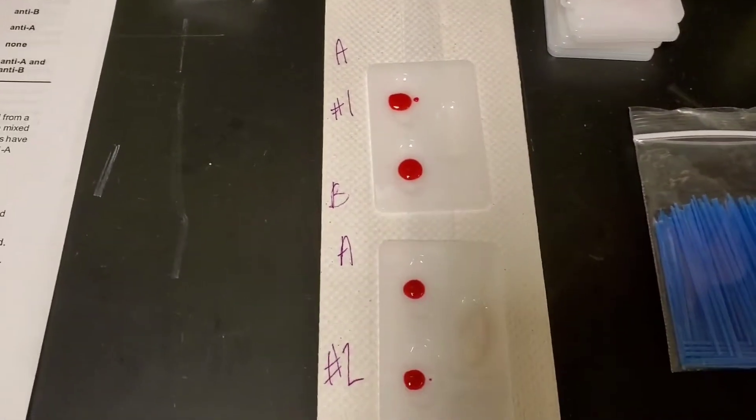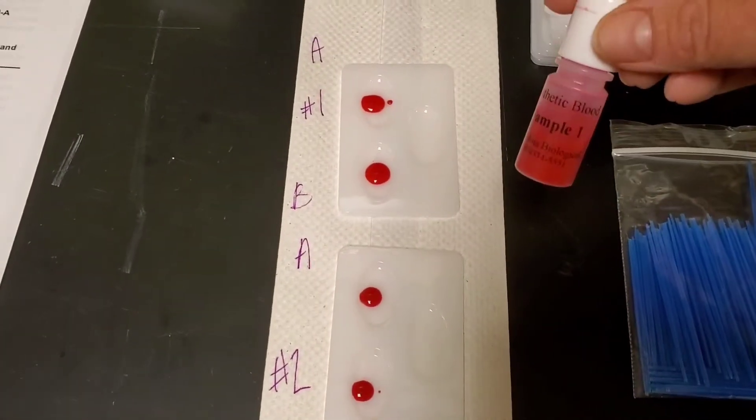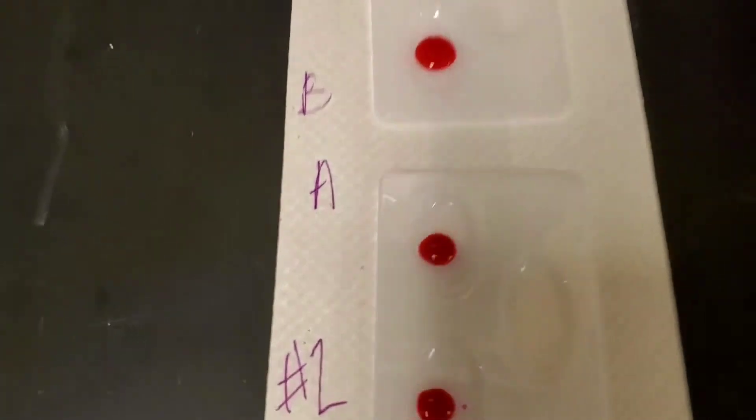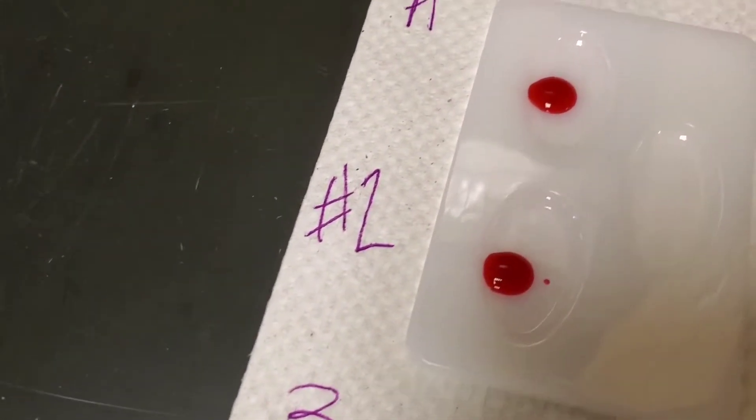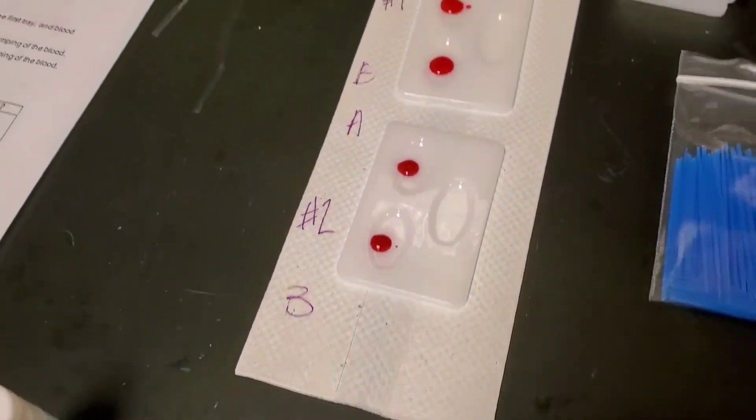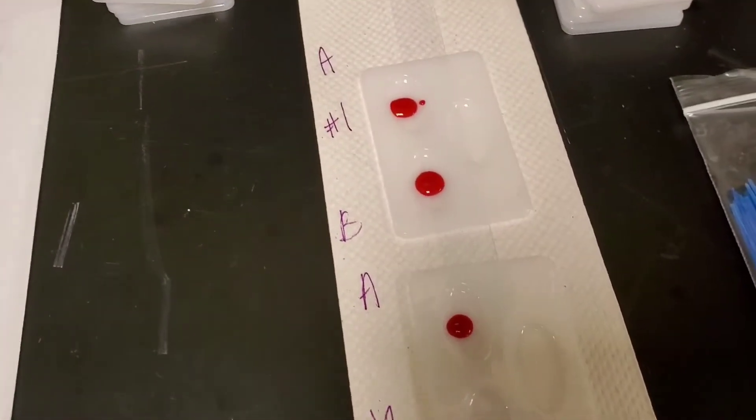Now I've taken the sample of blood and dropped it in there, so you can see it's shiny. There's no clumping going on, it's a homogenous mixture.